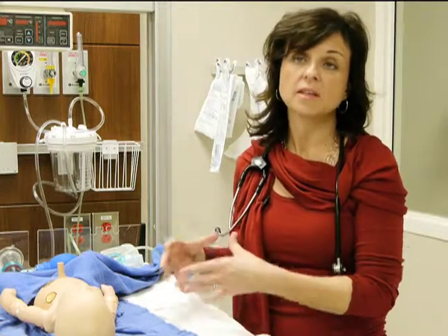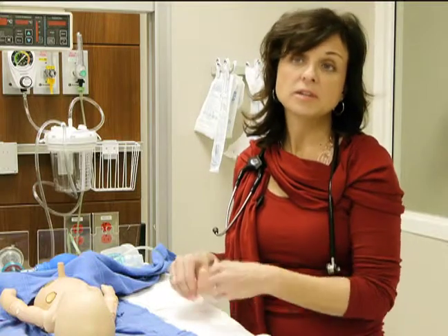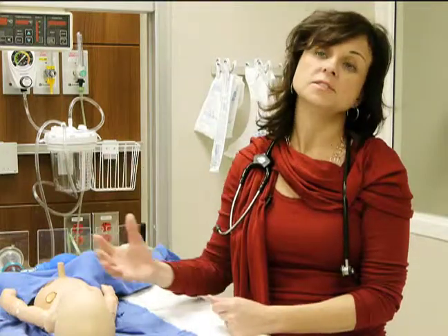therapy to them. So really, the purpose of the simulators is to try to make the synthetic learning environment here as real, or as much like the healthcare setting as possible. So they're really here to give cues to the learner of what they should be doing next, and for us to be sure that the learner is taking that information and processing it as a healthcare provider and making those decisions.